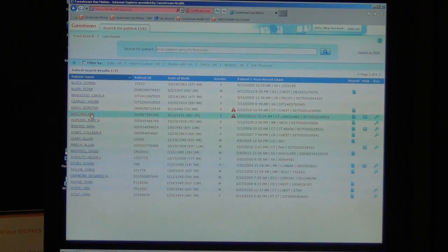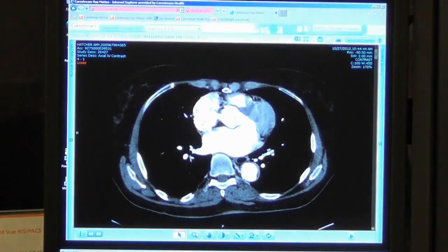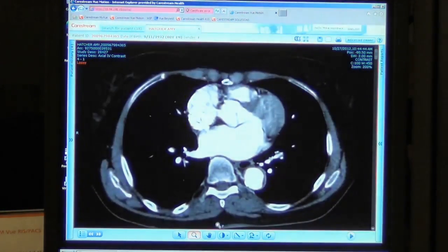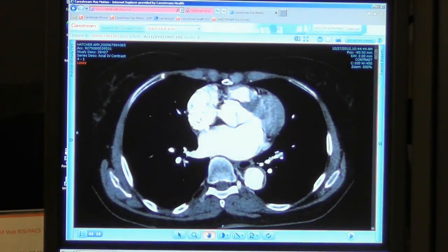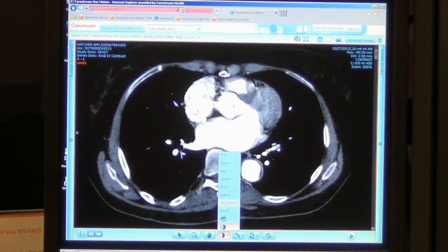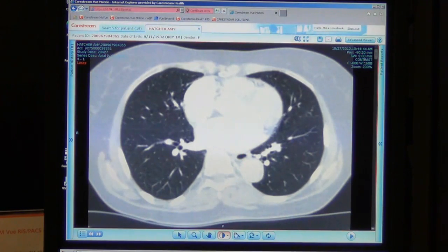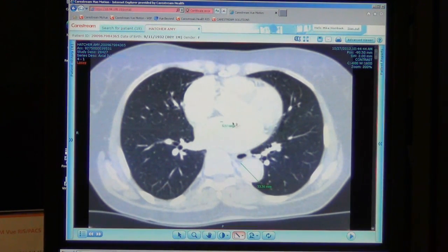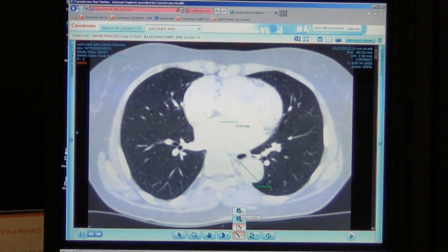To view the actual studies, I simply select the patient name and up comes the current image along with a very basic tool set. Included in this tool set is zoom, pan, window level, or I can use presets that have been built into the system. I can also do line measurements, and I can come in and delete those measurements.